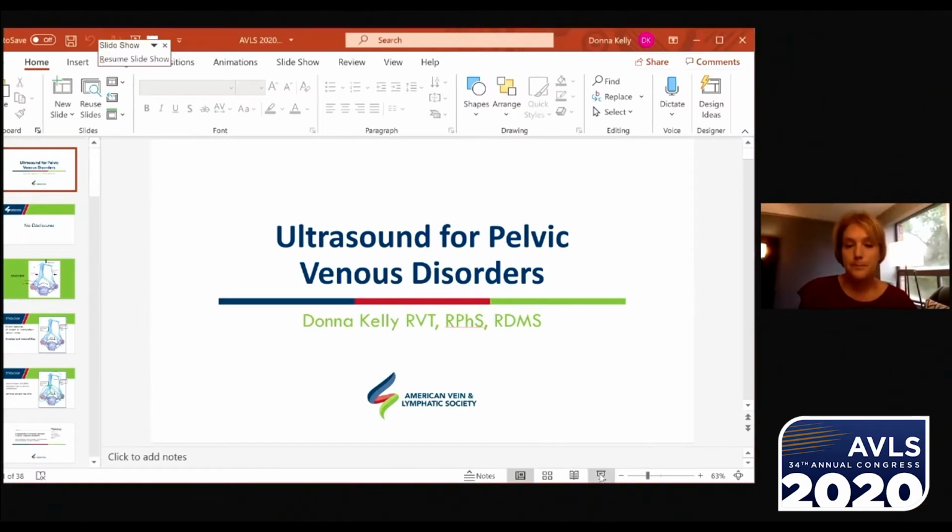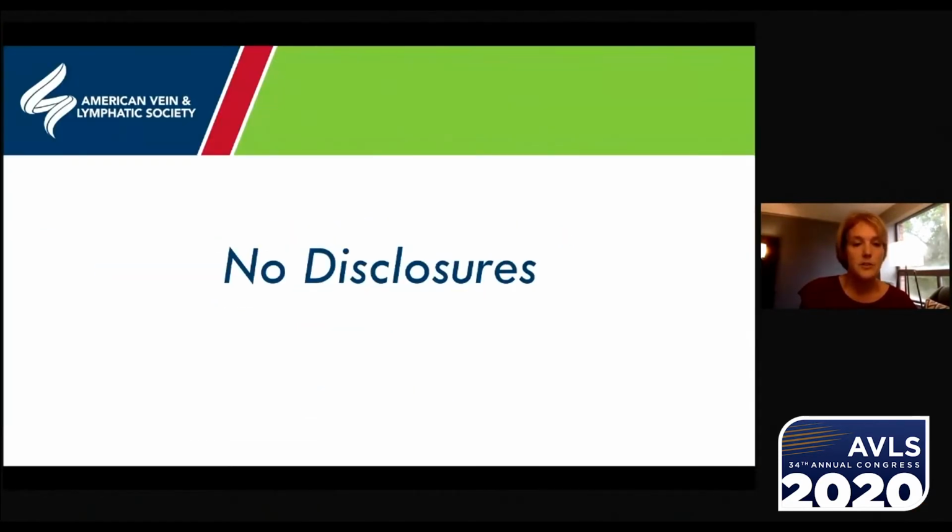I will be moving in to give the next talk, and I'm going to be speaking about ultrasound for pelvic venous disorders. Okay, so I have no financial disclosures.